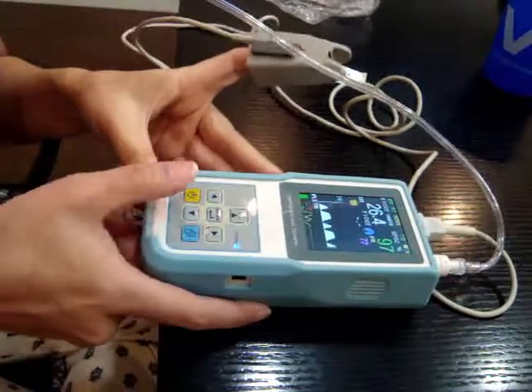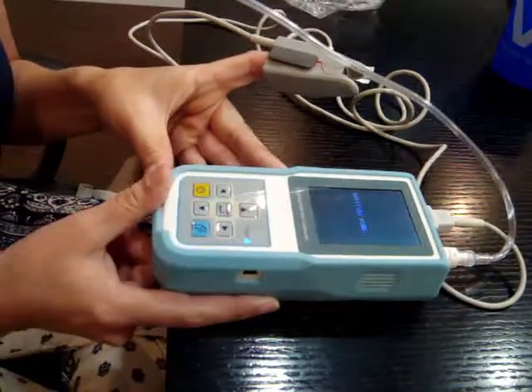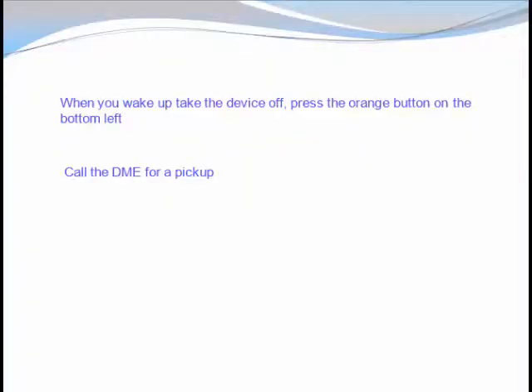Step 6: When you wake up, press the orange button located on the bottom left of the device, then take the finger probe off of the finger, then call the DME or arrange a pick up. Congratulations on successfully completing the CapOx Overnight Oximetry Test.